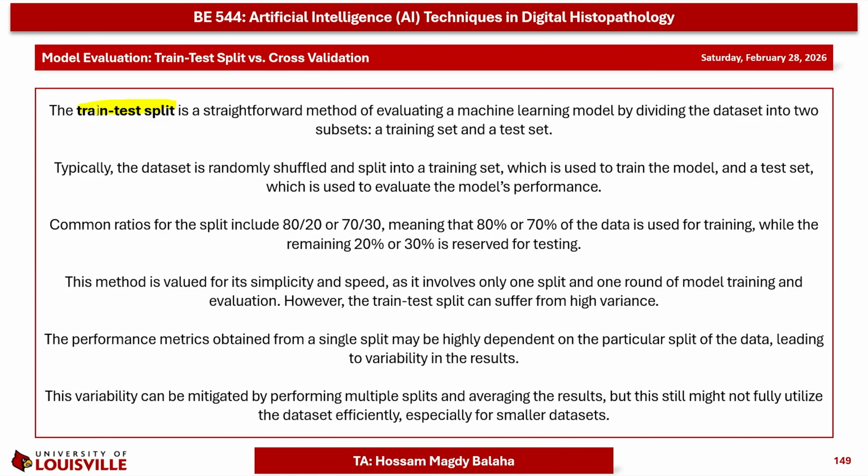So before starting the training process, we need to ensure that we are splitting our dataset. We are splitting our dataset aiming to judge and evaluate the performance of the training process. Imagine that there is a student who has learned during the whole course without any examination. Then you will not be able to judge the performance of that student.